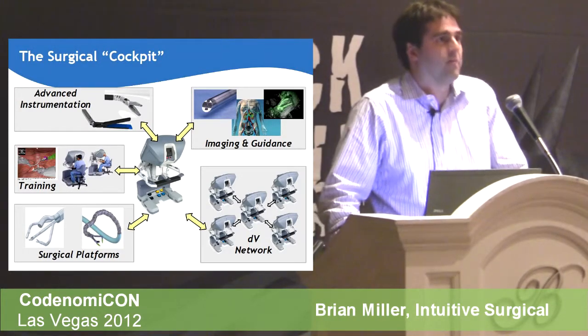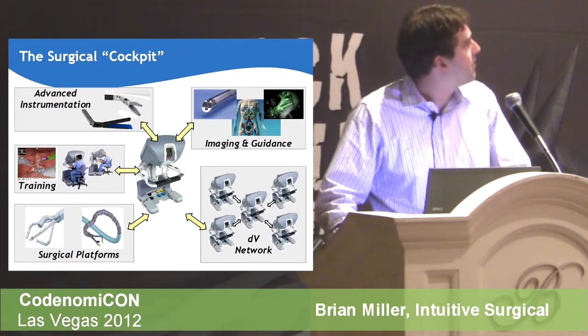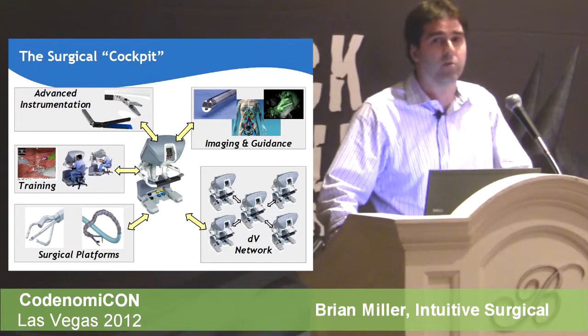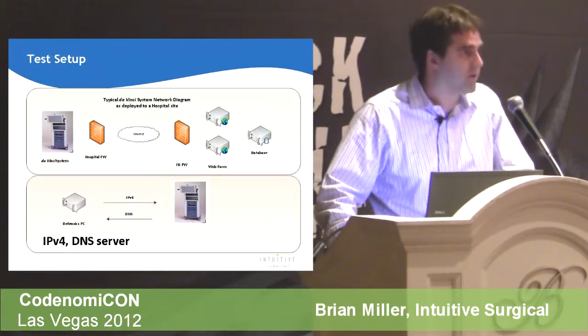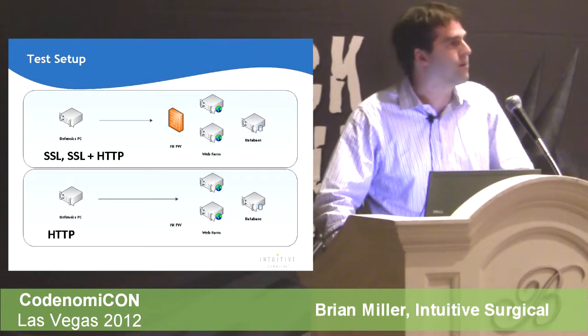And then when we get down there, obviously we're building in these capabilities for a reason. We wanted to be reliable and robust, but we do have very stringent checks inside of the embedded system, especially for some of the network communication, where if it doesn't understand what's going on or receives a packet that it doesn't recognize, then it will just shut down its network communication, not communicate out any longer until the system goes into a different state. And so ours is patient safety, making sure it doesn't impact the system, but then clearly we want to focus on having uptime associated with our applications that we have built in there.